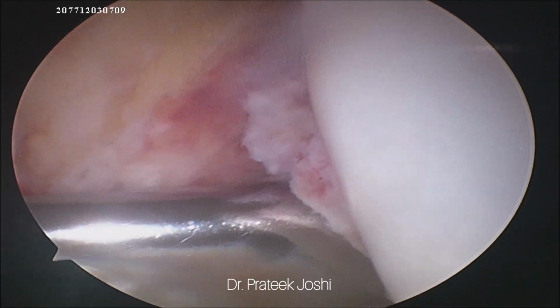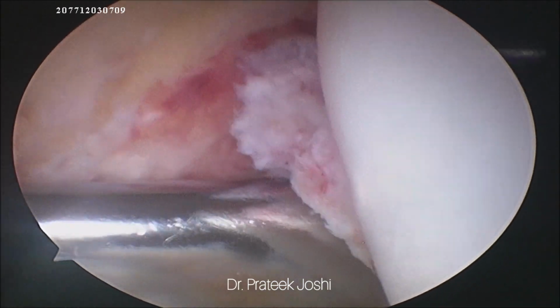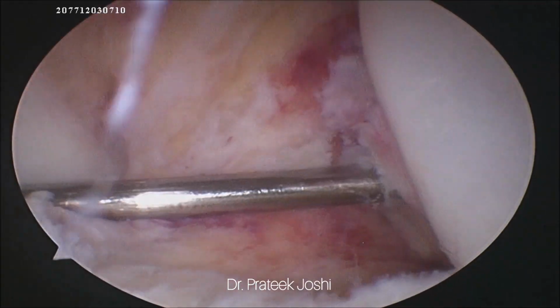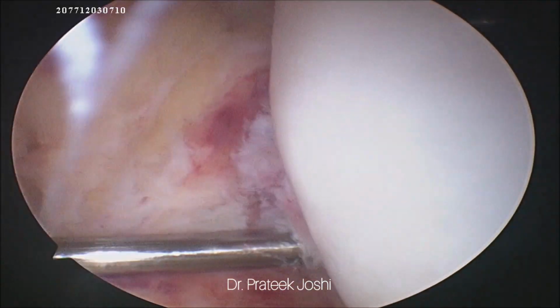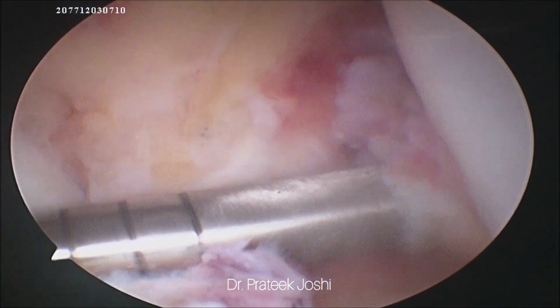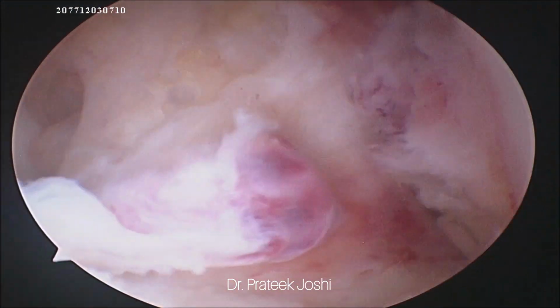You can see that I am viewing from the anterolateral portal. I have inserted my femoral guide which is 7 mm offset from the anteromedial portal, and I have drilled my guide wire through the lateral femoral condyle, and now I am going to drill over the guide wire with the endo button drill bit. Provisional length of our tunnel is around 40 millimeter.